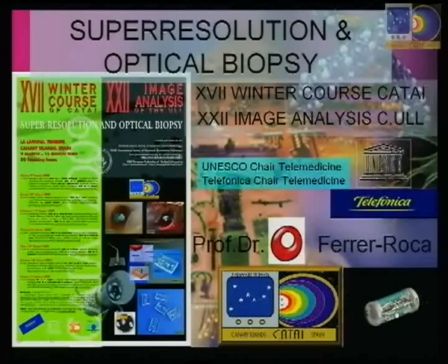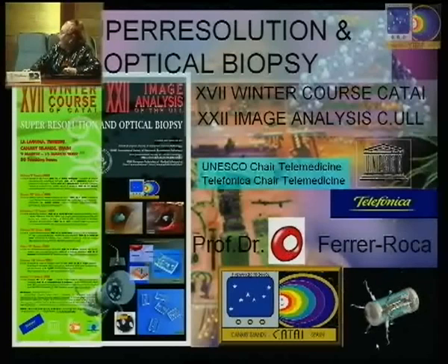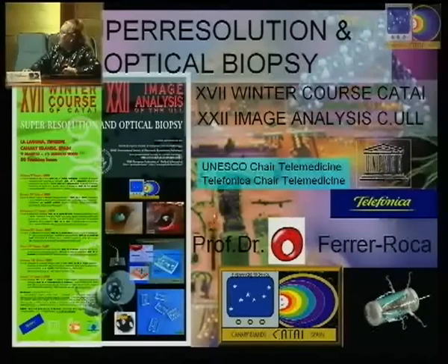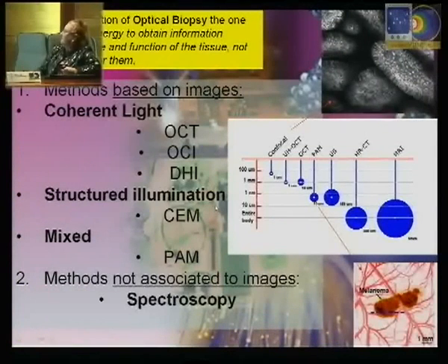Okay. In here, as you will see, there is an endoscopic capsule of the latest generation that has active moving, and during the presentation we will see that it is also able to take samples from the tissue.